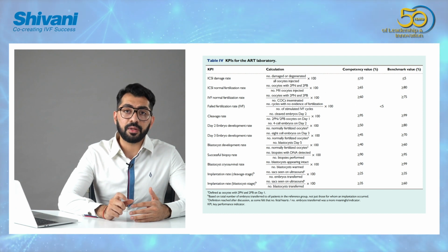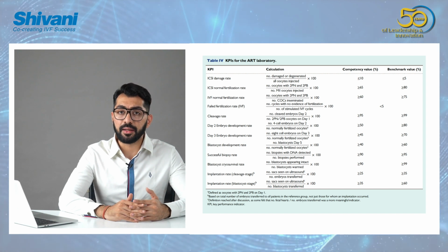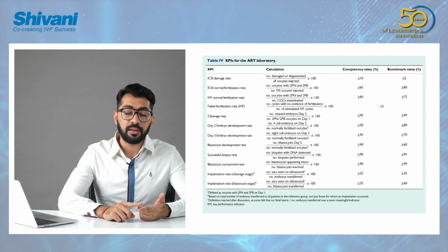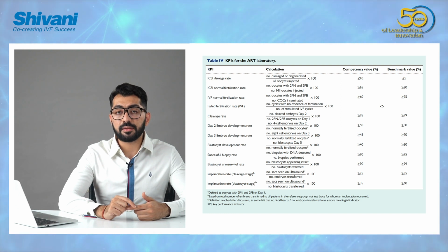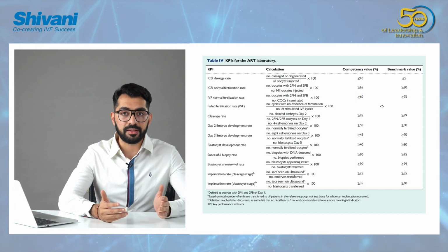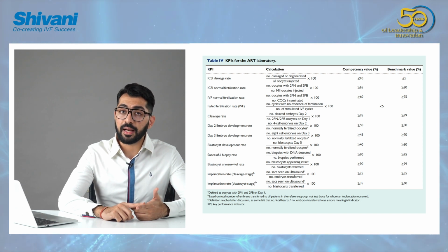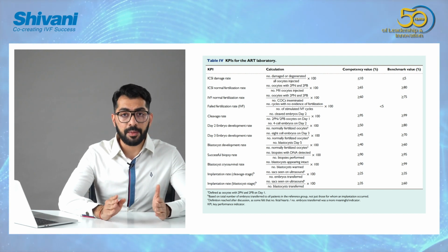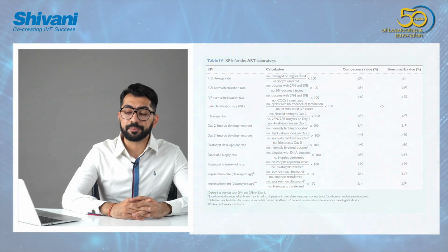Now the last KPI that we want to assess is the successful biopsy rate, and this basically is the number of biopsies in which DNA has been detected and amplified divided by the total number of biopsies that have been done. Again, this is a good indicator of the skill of the embryologist, especially the skill of tubing of the embryologist. It sometimes might also tell us a little bit about the shipping conditions of the sample. Let's say the shipping conditions were not established properly. In those scenarios, the amplification rate might vary. It can also tell us about the quality of the genetic laboratory, and that's why if you're doing biopsies in your clinic, this is an important rate that you would want to consider measuring in your lab.